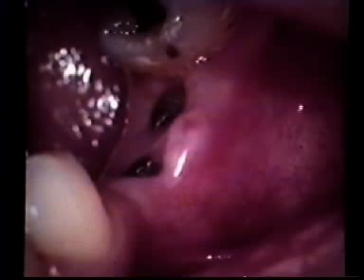And now I'm going to show you some cases where I think it will be better if we use two implants instead of one immediate implant in molar extractions. This is a colleague who is president of the College of Dental Surgeons of Guadalajara and national vice president of the Society of General Dentists. He wants me to pull out his fractured root and replace them for immediate implants, as you can see on the right. And here you can see the beautiful and healthy tissues. On the right, the posts are ready for the crown. This is the crown made with a new material called Arglass.